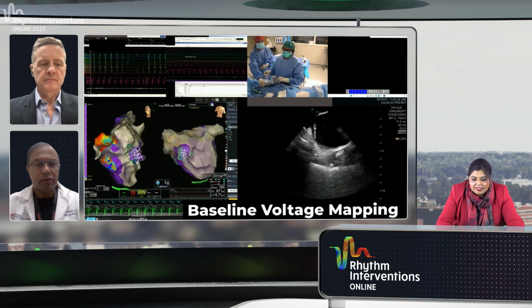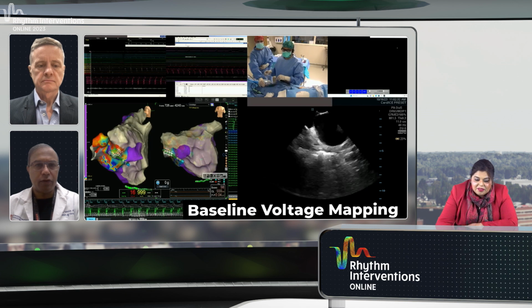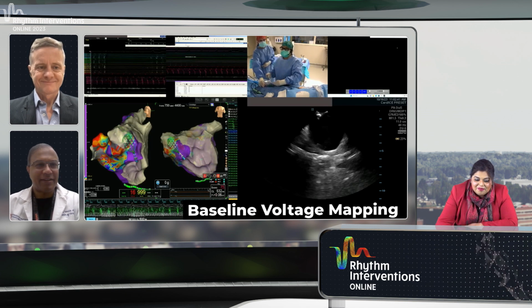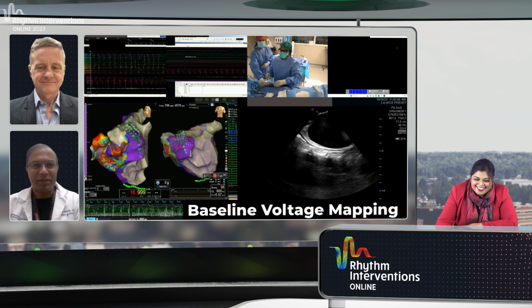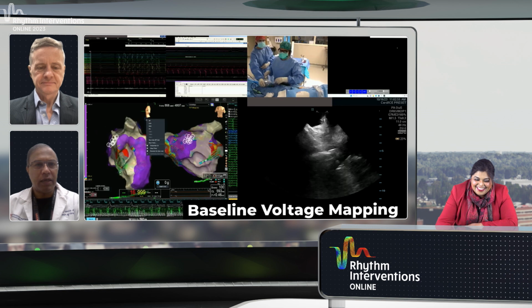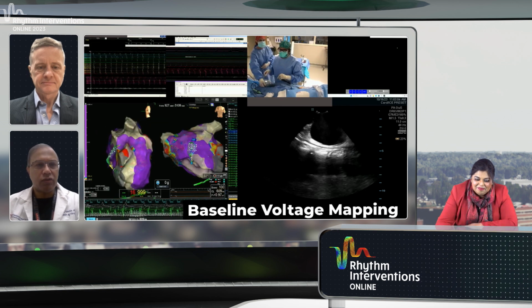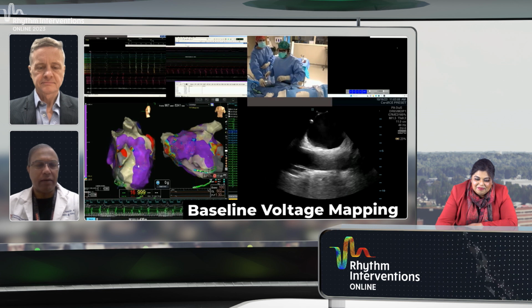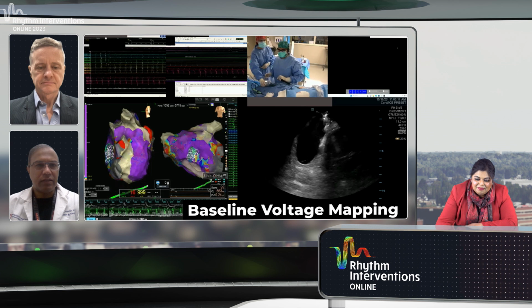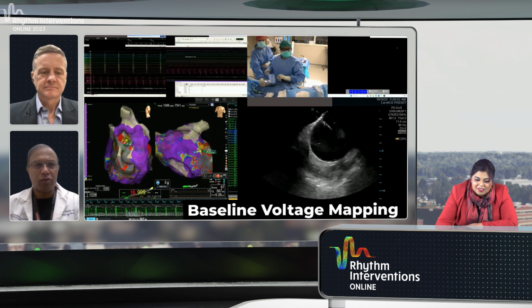I don't have any particular thoughts on the poll question. Maybe a none of the above might have been a nice option as well, because I'm not sure that we necessarily know what we're doing. But it's very interesting to me as I'm watching you collect this sinus rhythm map, that the voltage outside of the veins seems pretty normal, especially given the presentation.